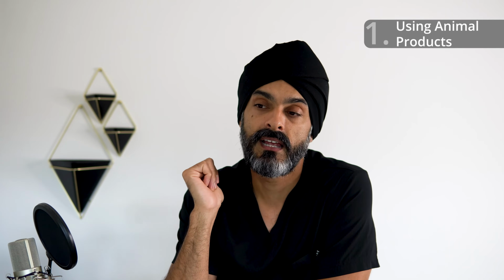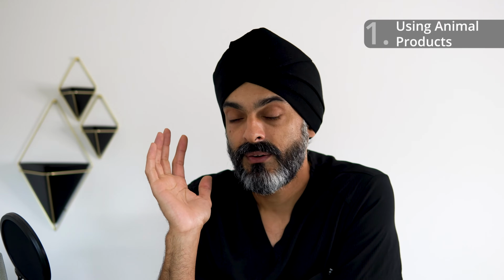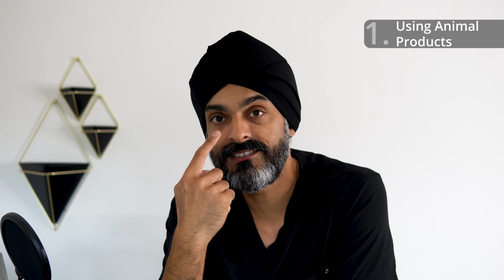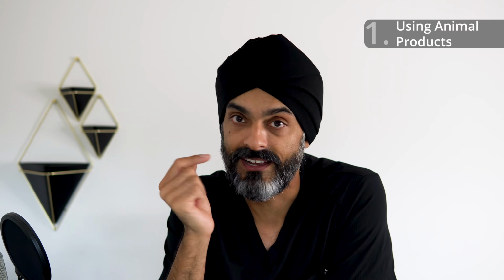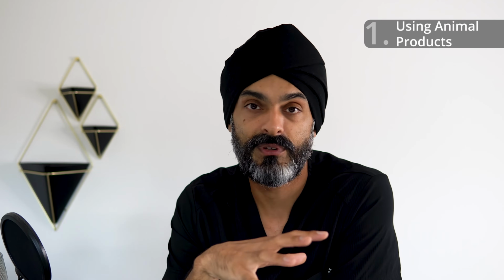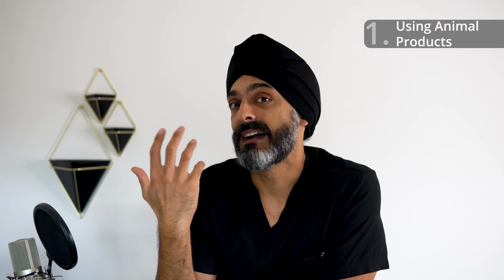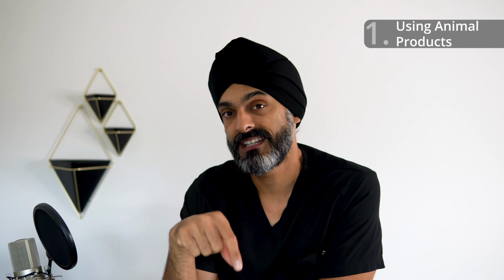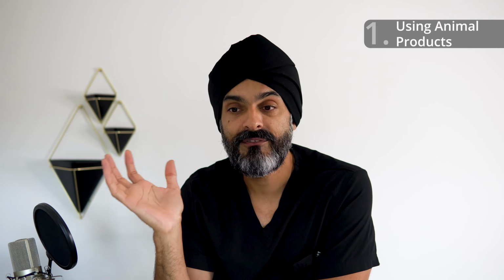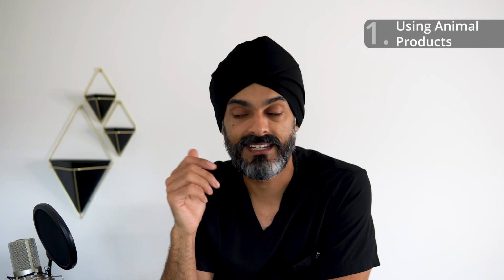Number 1 is it only involves one surgery. Okay, so when we're doing a bone graft, if we're treating the front tooth, we only need to numb up and do surgery on that front tooth. It's very convenient. We get the material in a bottle and we pack it where we want to go. And sometimes we don't even need that bigger graft, so we can put the implant in, do this bone grafting and close everything up. All the surgery is done in one go. It's really neat and tidy and convenient.